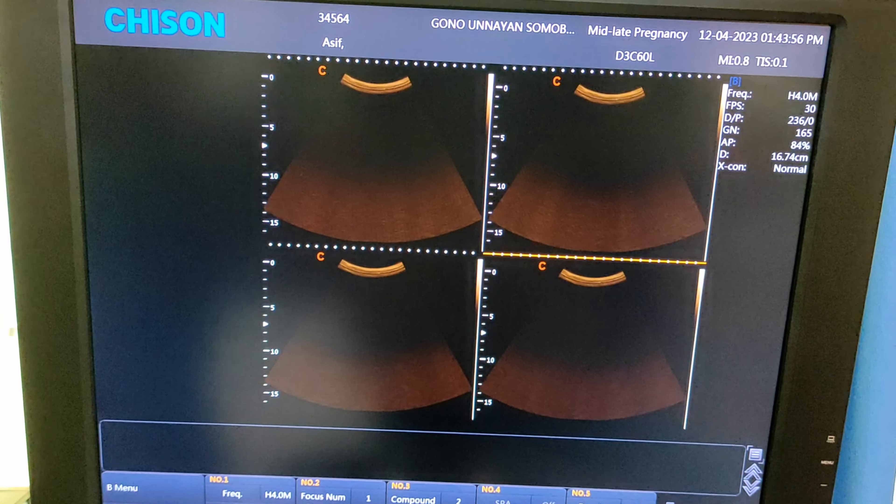To preview, go to cardiac. It will allow you to print more images. Now click on this icon to select all your saved images. Now press preview. Go to 'Shrink to Fit' — here it is showing different types of percentage, which will help you to print more and shrink your image.